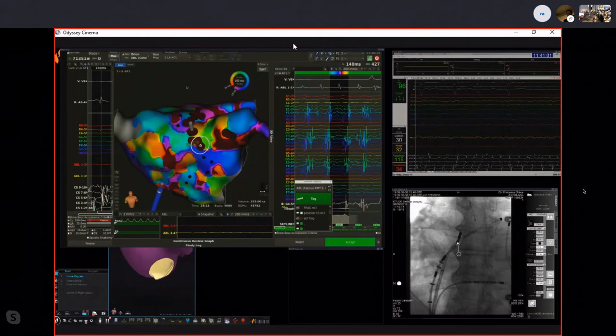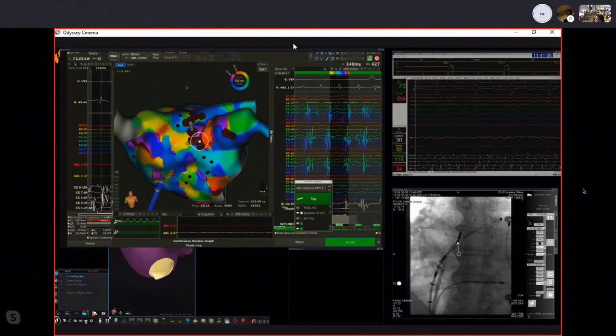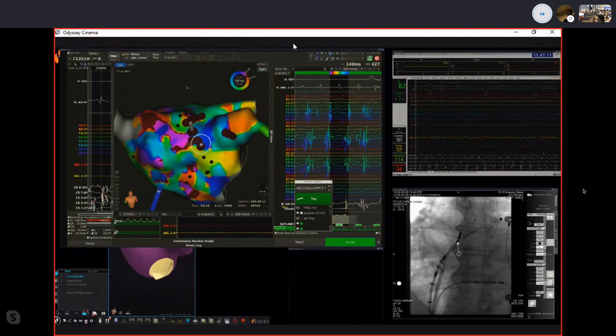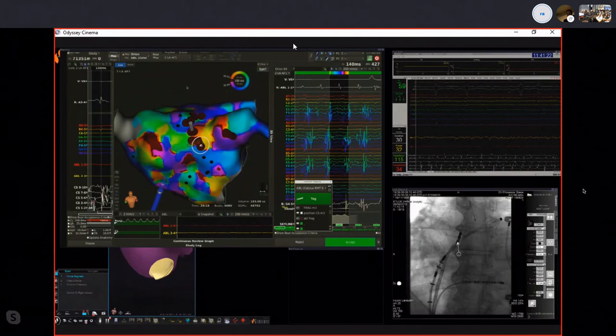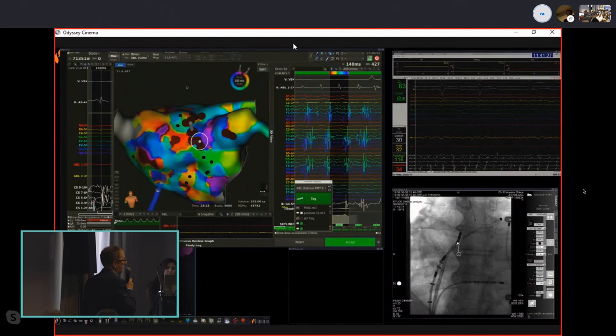How much longer do you expect to spend with the patient on the table? We shall continue to ablate all the drivers that we can diagnose. The mean average number of spots for one map is about 7. And if afterwards we are still in AF, we are going to remap and see if we have some residual drivers. So it all depends on how it goes on. We will try to come back to you. We will move now to the live session.